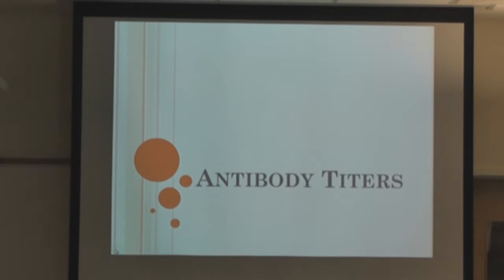Now after they started doing component therapy, we didn't really do the titers so much anymore. I do remember days when we did have units of whole blood on our shelf, and we had units of packed cells, and occasionally you would have to order for whole blood, and you would give the unit of whole blood out. And if you needed that red cell, but you didn't need it to be a whole blood, you needed a packed cell, you could pack it.